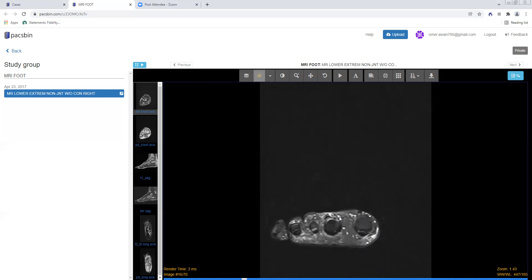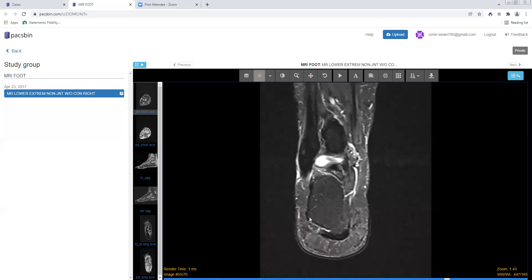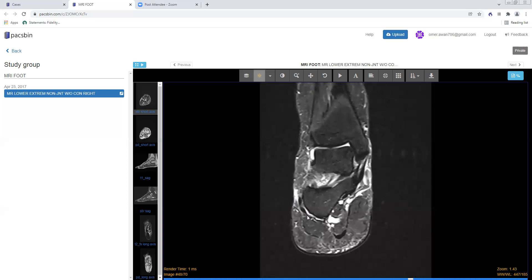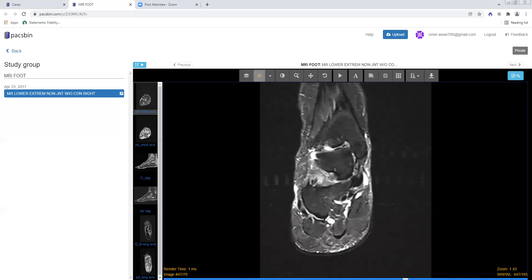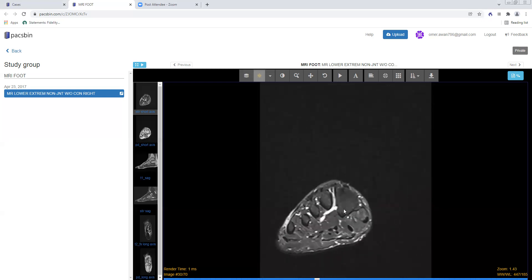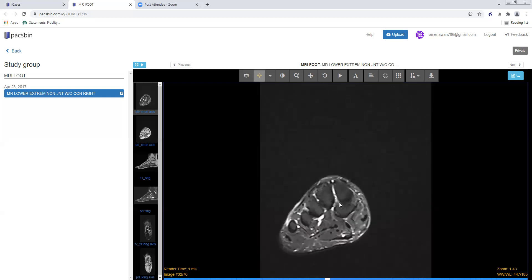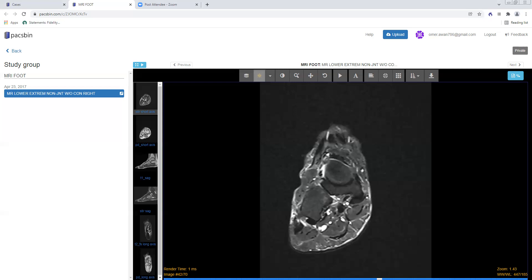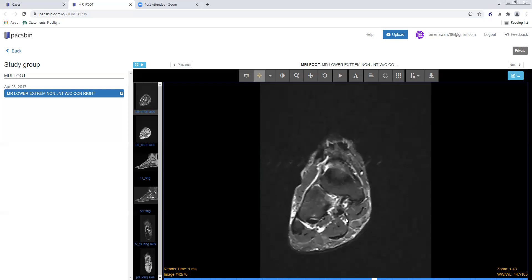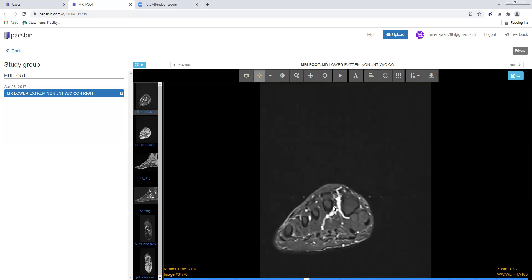Looking at the peroneal tendons, the peroneus longus turns onto the base of the first metatarsal. There is some tenosynovitis around the peroneus longus with fluid around its tendon sheath. The peroneus brevis inserts onto the base of the fifth metatarsal as it should, and the longus curves around to the base of the first metatarsal. That's a nice overview of how to look at the bones, joints, Lisfranc ligament, collateral ligaments, all the tendons — flexor, extensor, abductor, and adductor — as well as the muscles and soft tissues, including the subcutaneous fat for signs of cellulitis. That's a general approach to MRI of the foot. I hope that was helpful — thank you so much.